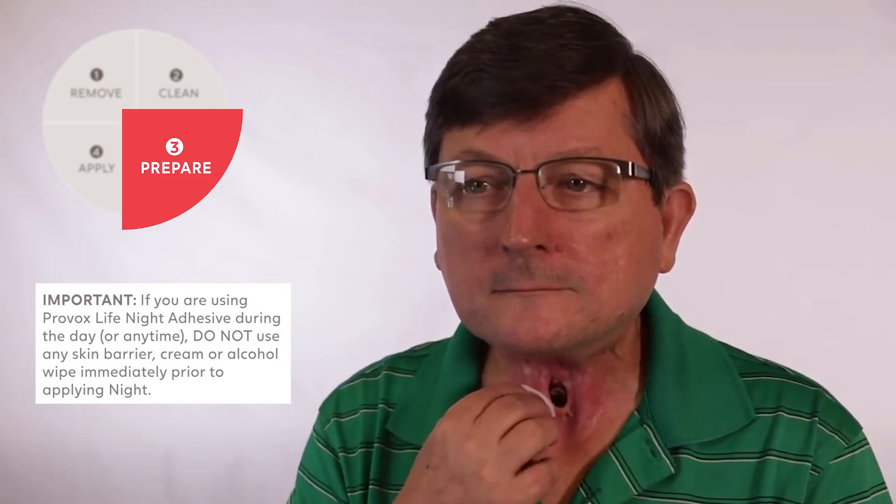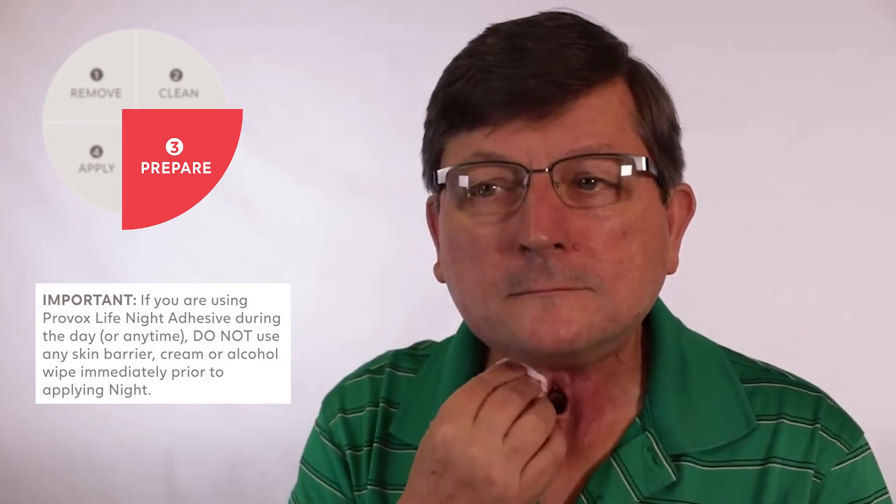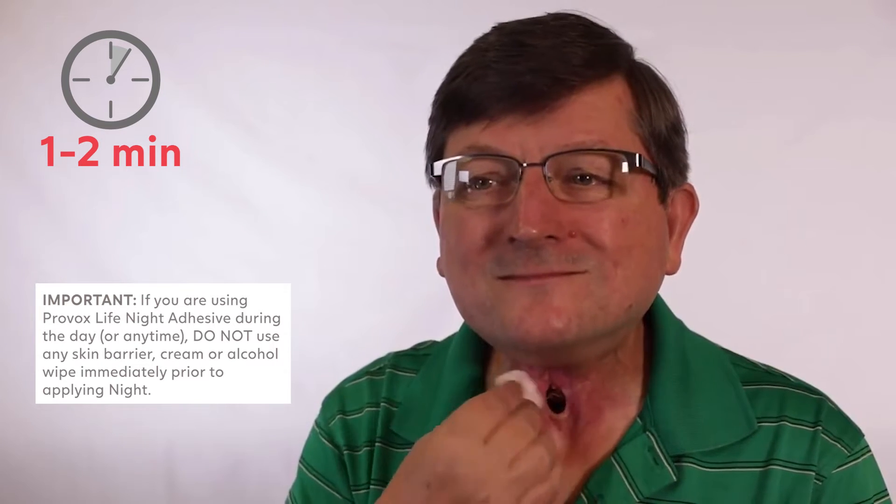Then, prepare the skin for your adhesive by applying Provox skin barrier. Allow the skin around your stoma to dry completely, which should take around one to two minutes.